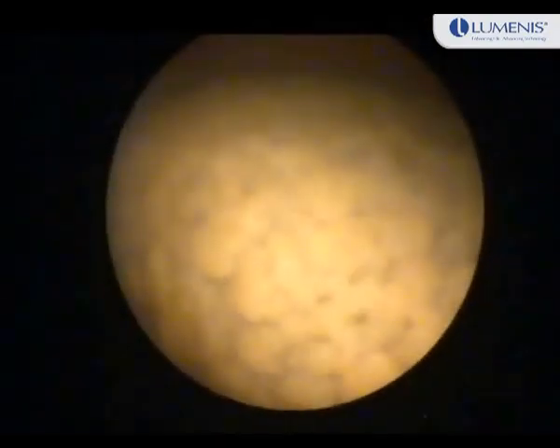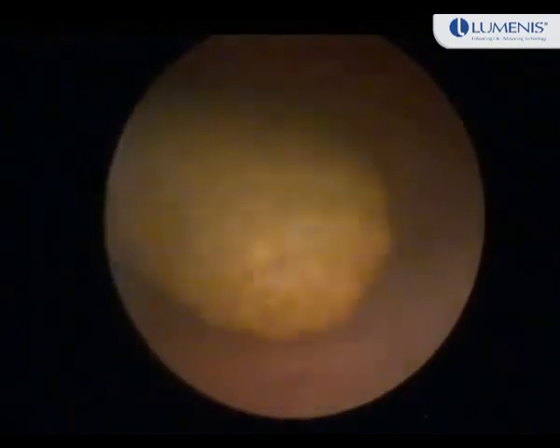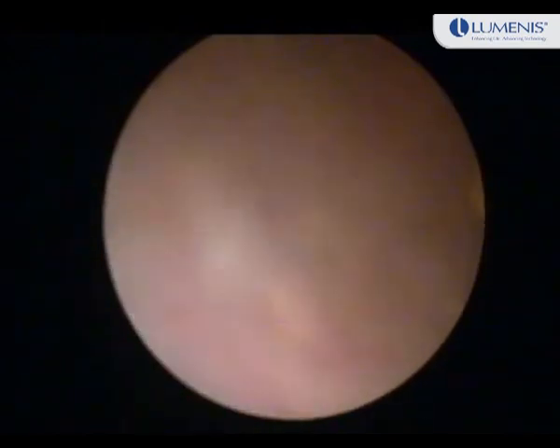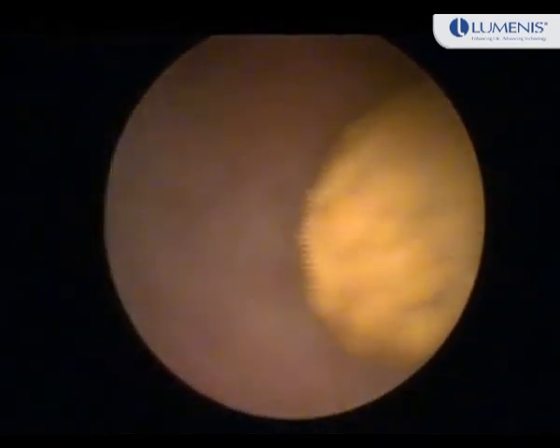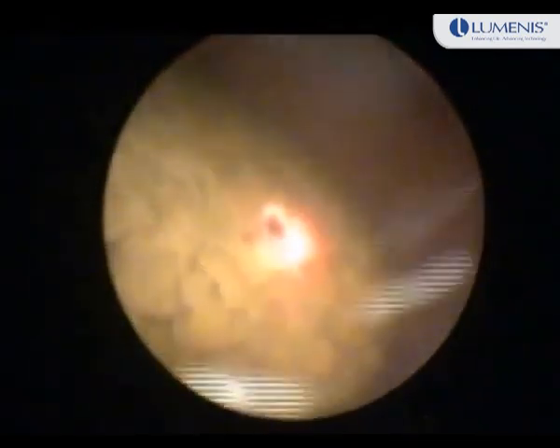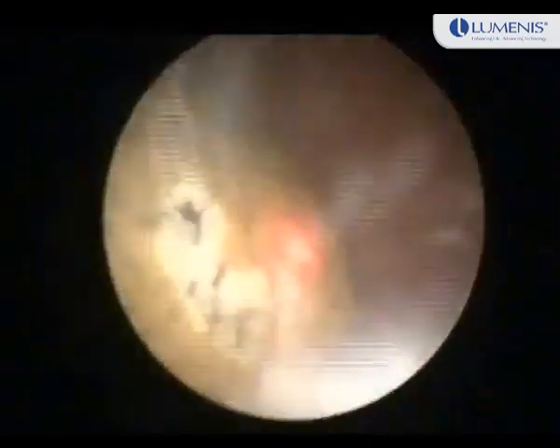This child presented with a large bladder stone with right renal upper calyceal stones. The surgery was contemplated in two stages. In the first stage we are dealing with the large bladder stone. This is a 550 micron fiber introduced through an 8 by 9.8 French URS, with energy settings of 0.3 joule and 50 repetition rate.